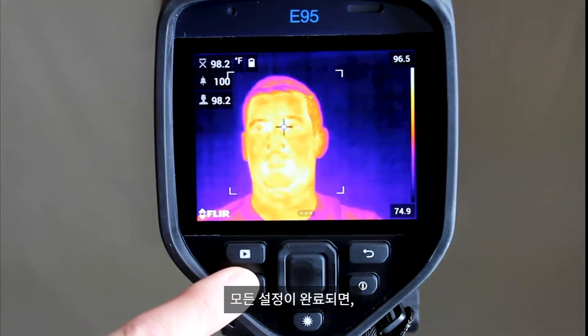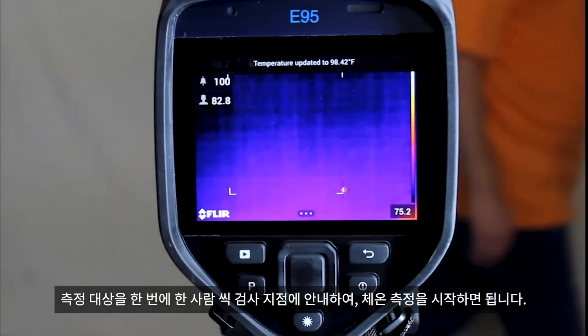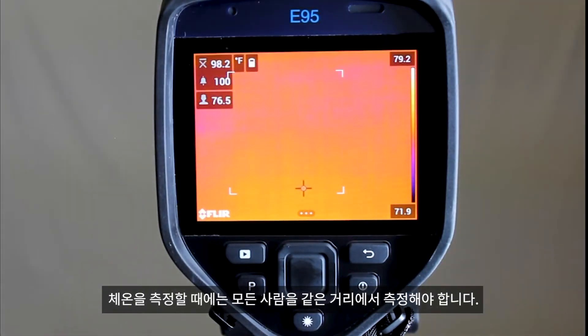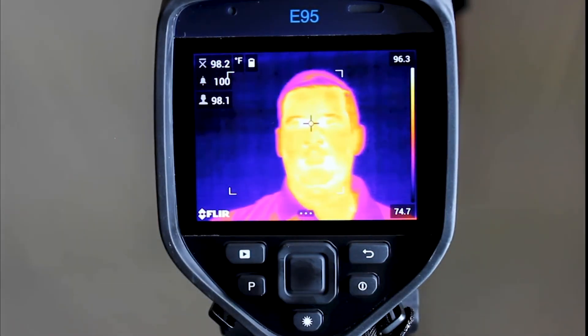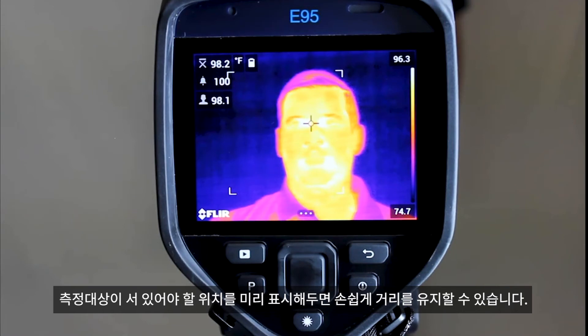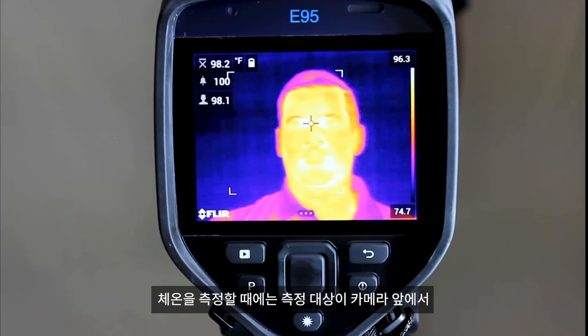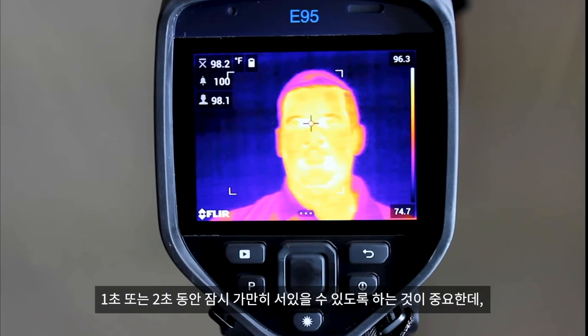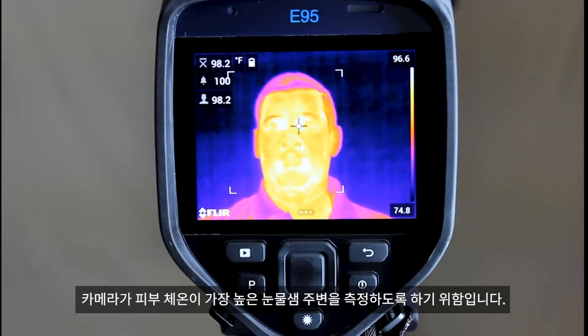When you have everything set, you can start moving subjects to the designated screening location, one at a time. Make sure that each subject is screened at the same distance. They should be positioned in the predetermined location that has been marked on the ground. Have them pause for one or two seconds to allow the camera to focus in on the hottest spot, which should be the corner of the eye, near the tear duct area.